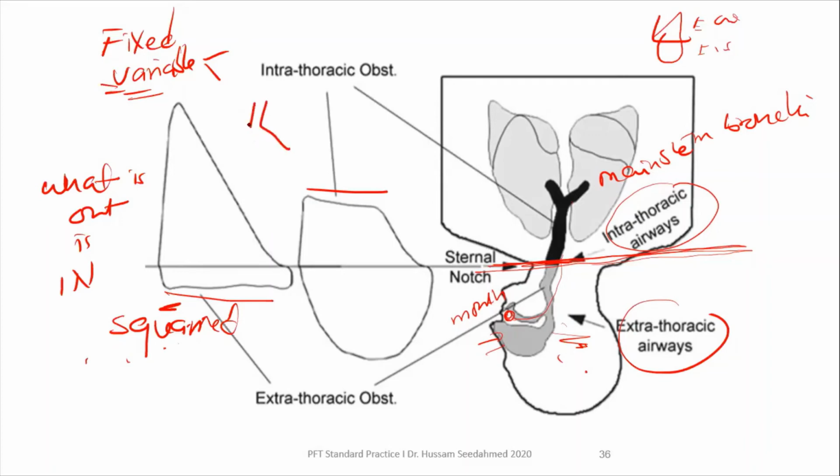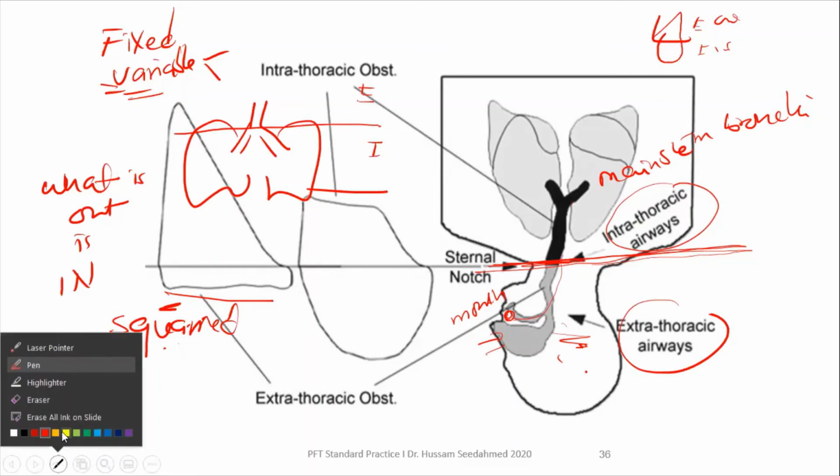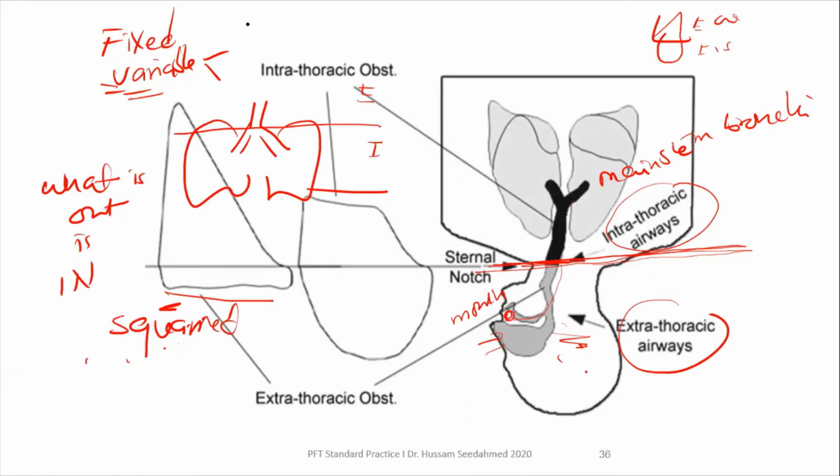طيب just a little bit of small physiology. Now إذا أخذنا مثال إنه this is my airway. قسمناه into extrathoracic وهنا intra. So say for example this is my lesion. نمسك for example an extrathoracic, هنا عندي lesion هنا.